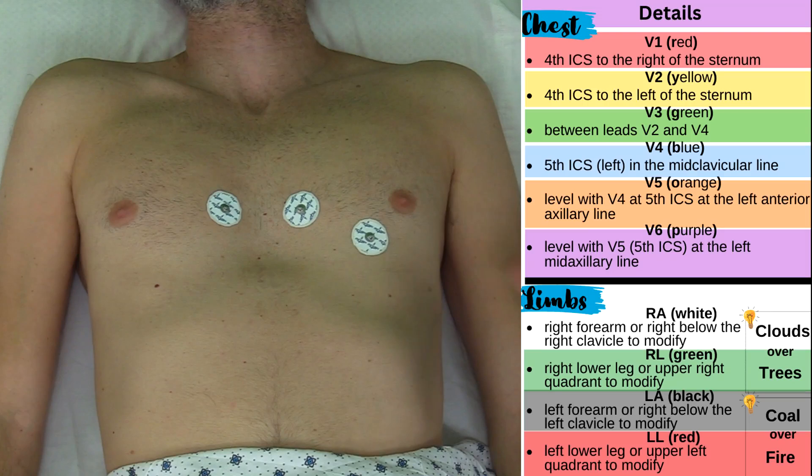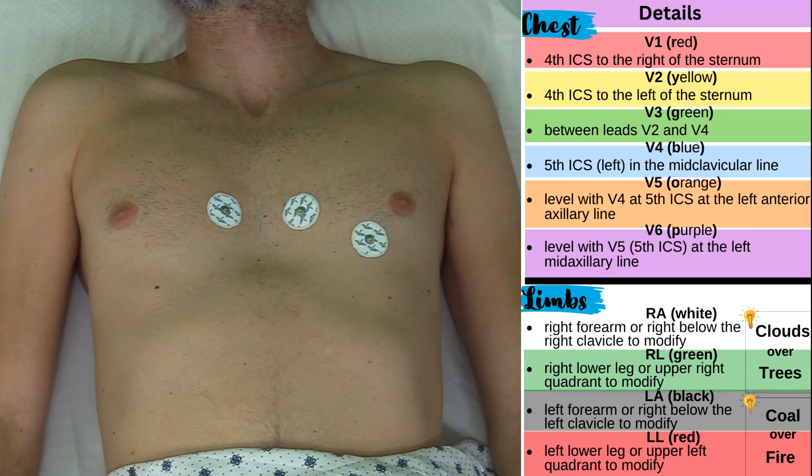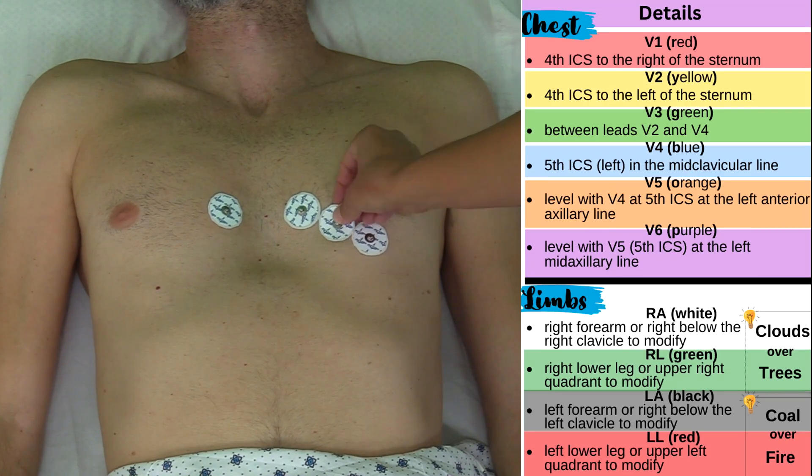Now I'm ready to place V3 and I'm going to place it between V2 and V4 at the midpoint — so about right here.